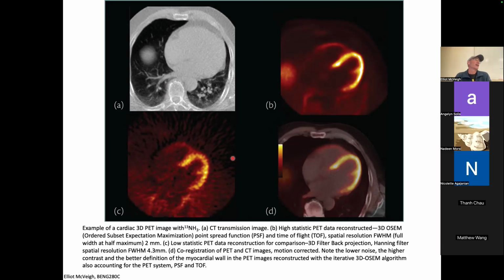So instead of doing that, you start with this picture, and then we say, okay, I have this picture. If this was my object, I use my forward model to create a new raw data set with this picture. So I create a new raw data set and I look at my actual raw data set and say, what's the difference, right?